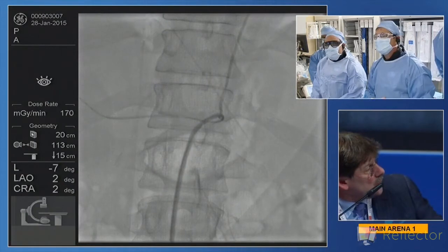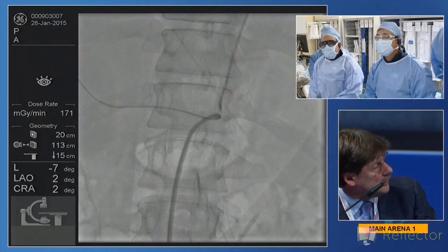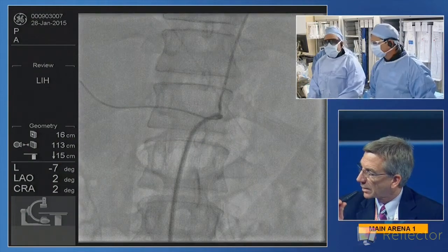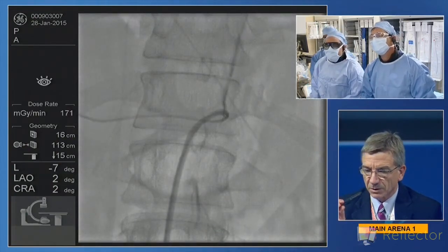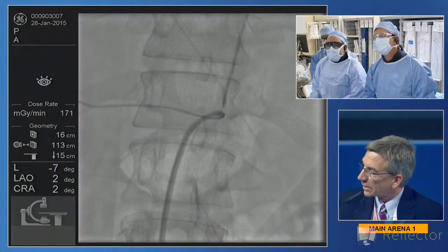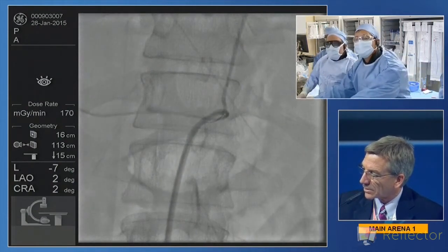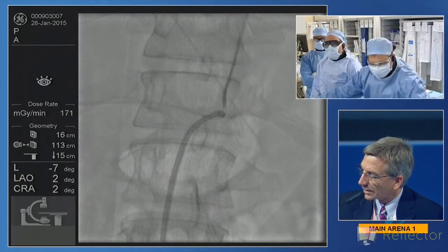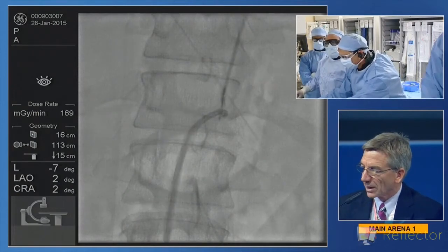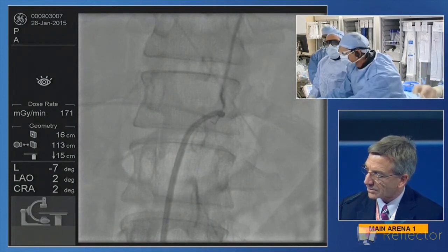Peter, one of our surgical colleagues, what do you think the sequelae is? Is there any consequence you expect when you coil the splenic artery here? Well, I think he's going to have pain when you do it. Yeah, I mean, he already had pain from his first small splenic infarct. But this is something that we do routinely. Just make sure he's got a pneumovax, and if he had a big splenic artery aneurysm, you would take it. Typically, the spleen, or at least some of it, does stay alive from the short gastrics. And we don't typically think of it as significant. The challenge here will be how to get a covered stent in there without affecting flow in the left gastric, and that's always a challenge.